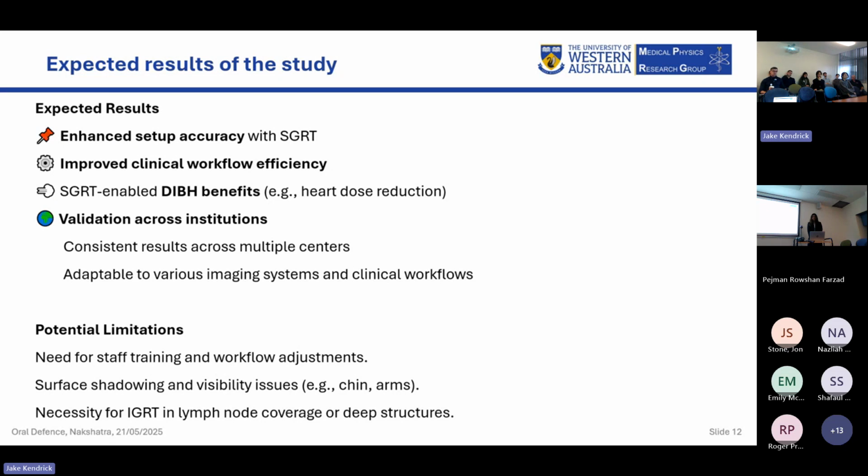I also expect limitations, which from my preliminary study include the need for staff training and workflow adjustment, which can be quite hard since it's a new technology. Some papers report surface shadowing and visibility issues due to the chin and arms. Another problem is that IGRT cannot be avoided completely. It still relies on IGRT, just that we can reduce the reliance on IGRT, maybe the frequency of IGRT.